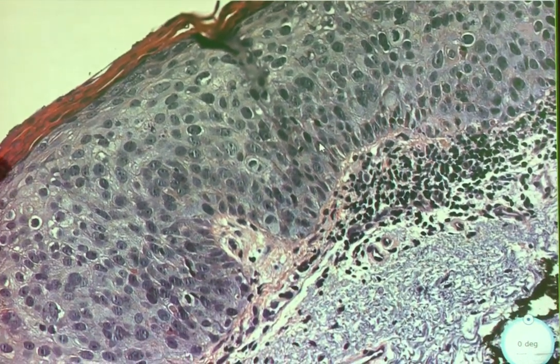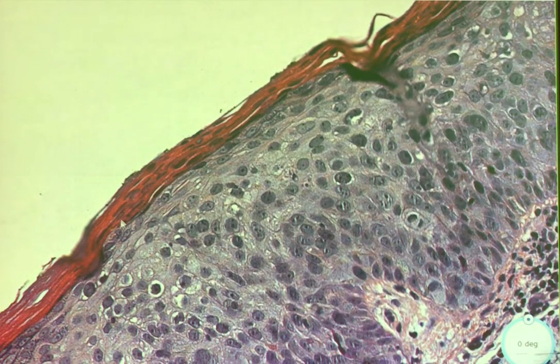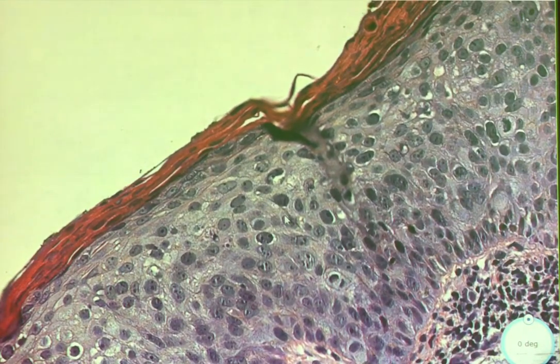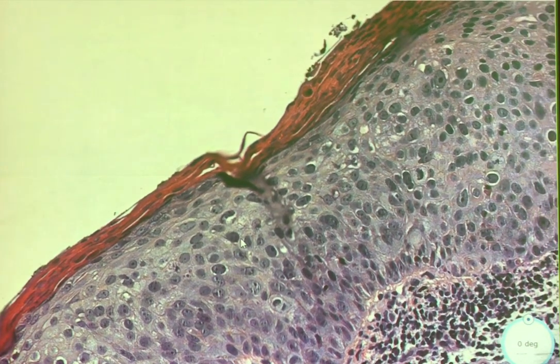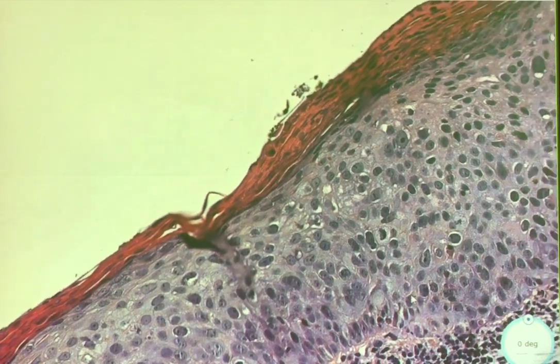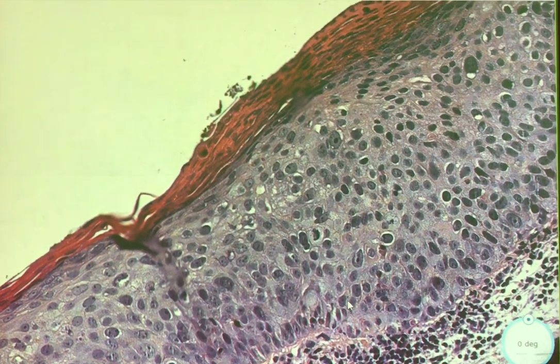Okay. So how about up here? There are nuclei here, so parakeratosis. We have parakeratosis, yes. And it's just too thick. You know, this skin is just laying down, it's giving up. It doesn't look like there's any architecture, like someone went, here's a bunch of cells and smacked it right onto the thing. You can't even say which direction. You could flip it around, get rid of the keratin layer, turn it upside down, and it looks pretty much the same.